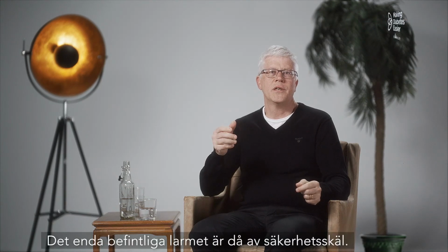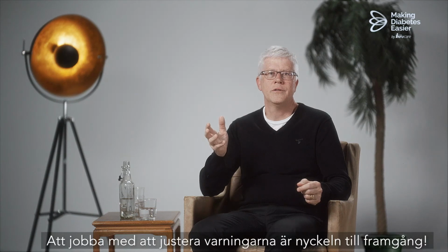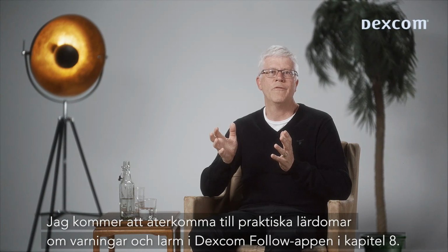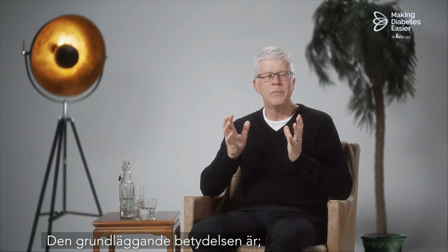The only existing alarm is then for safety. The work on alert adjustments is a real key for success. I will come back to practical learnings on alerts and alarms in the Dexcom Follow app in Chapter 8. But the essential meaning is alerts in time, proactive decision, and fewer problems.